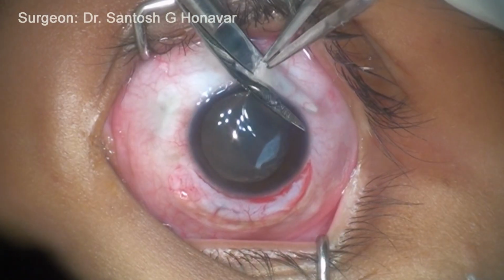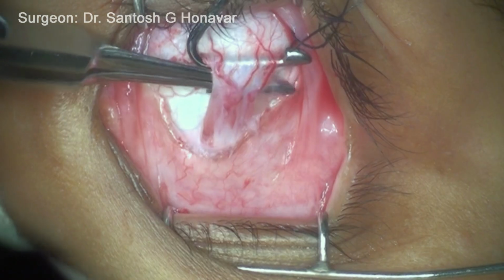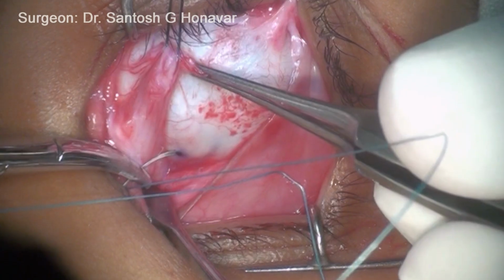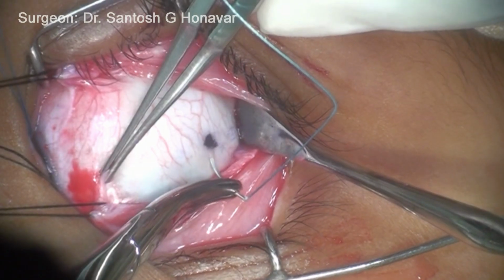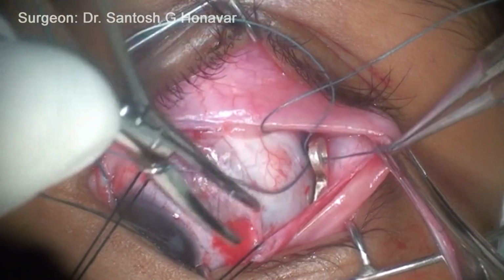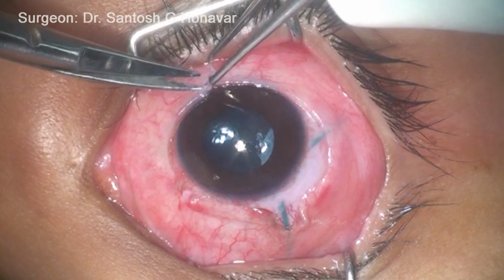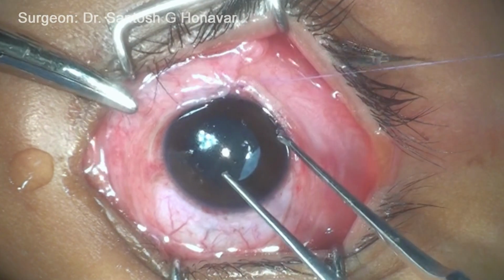For posterior placement of plaques, conjunctival peritomy is performed, recti muscles are hooked and tagged for the appropriate traction. The quadrant of plaque placement is exposed and scleral marking is done from the limbus. By suture, the spatulated needle is passed through partial thickness of the sclera, avoiding any sort of scleral perforation. The suture is now passed through the plaque islets and tied. Position of the plaque is confirmed and conjunctival sutures are taken for closing the peritomy. Plaque removal is done as per the pre-decided dosimetry timings by the radiation oncologist.